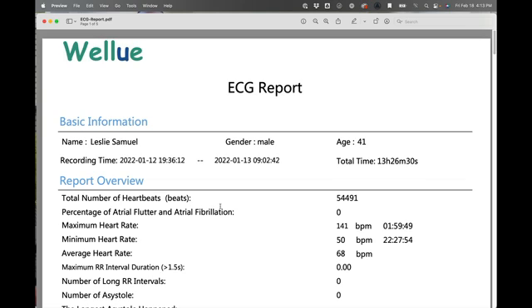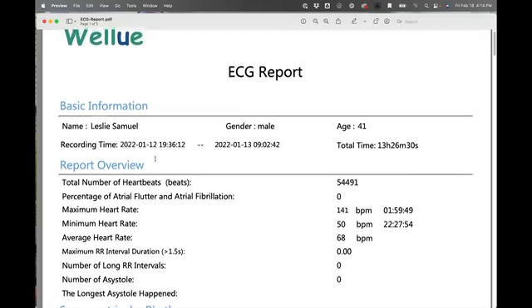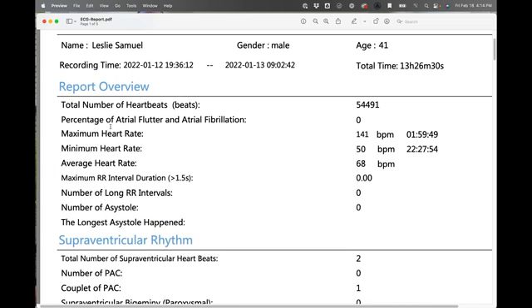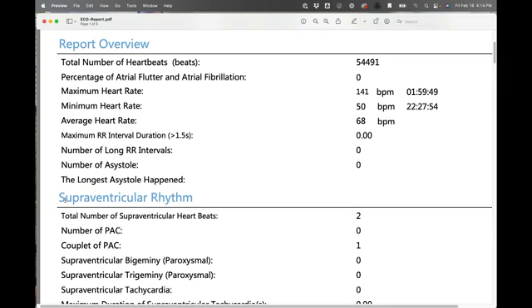So I did this — let's look at my ECG report with AI analysis to see how I'm doing. Here we have my ECG report. It gives some basic information: name, gender, and age. I'm not going to go through every single thing, but I'll point out some of the main things. You can see the number of heartbeats, maximum heart rate, the percentage of atrial flutter or fibrillation, average heart rate, minimum heart rate, the maximum RR interval, and whether there are any supraventricular rhythms.